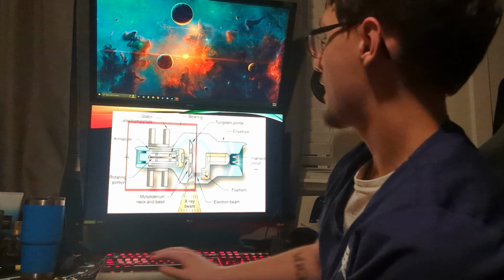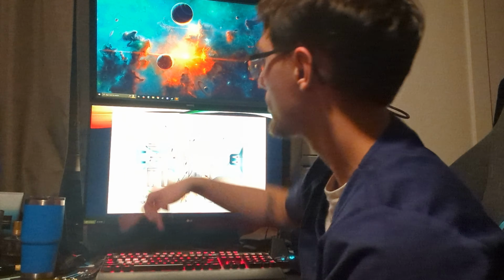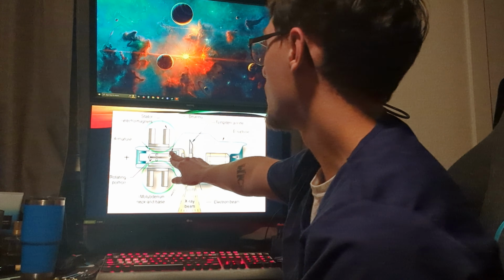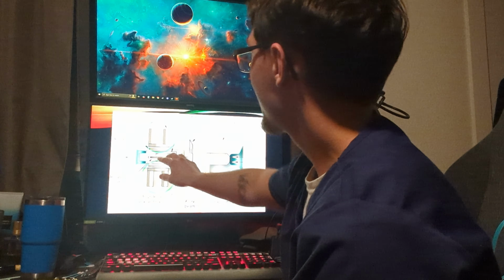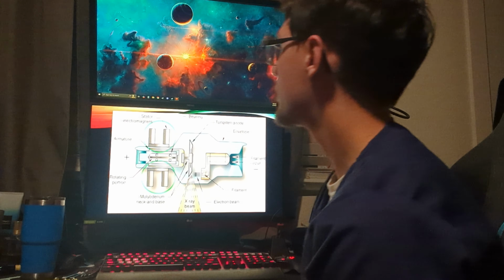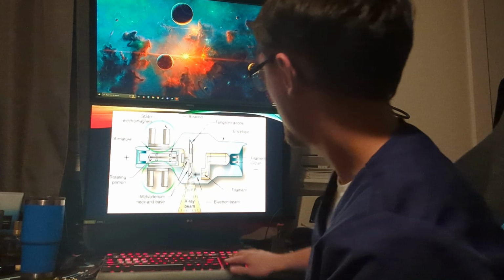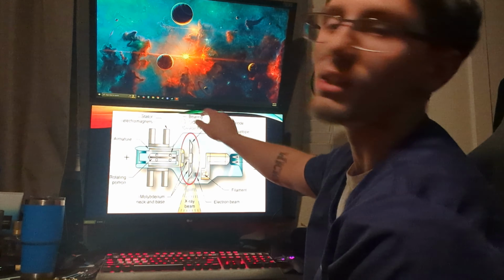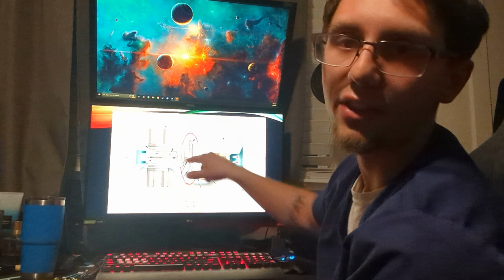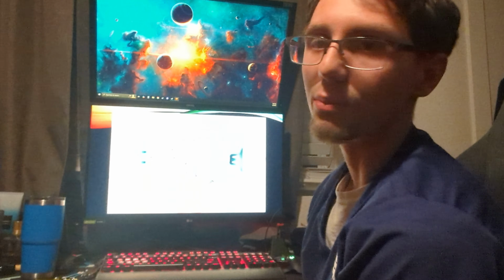All right, so now let's talk about the left side over here. This whole left side will be the anode side, and it's going to be broken into a few different parts. First, let's talk about the stator electromagnets. Basically, these electromagnets will cause this inside portion of the rotor here to rotate. It acts on this armature and these bearings here, and through the use of electromagnetism, it causes this entire thing to spin at 3,000 to 10,000 RPM. This entire disc will be spinning at 3,000 to 10,000 RPM, and that is essential for the heat dissipation that rotation provides.